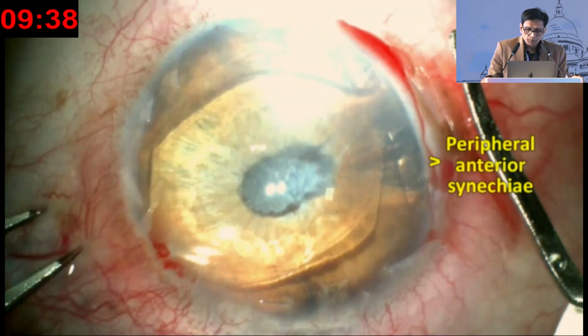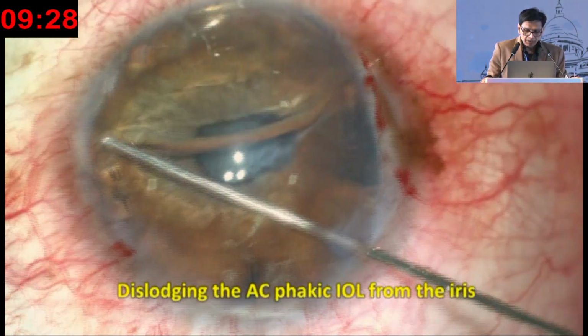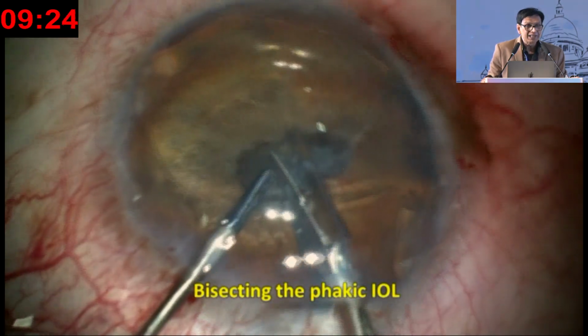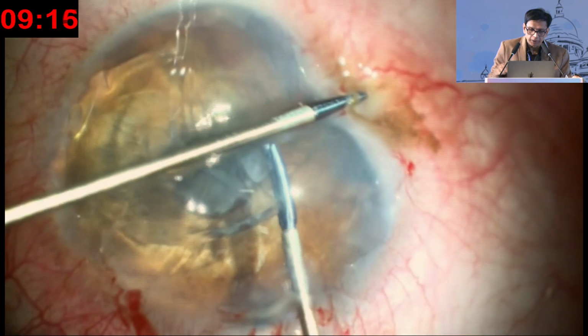You can see now, I'm taking off the epithelium to see better. Look at the peripheral anterior synechiae on the anterior segment OCT. And you can see this is the anterior chamber phakic IOL. Look how mobile it is. That's why this patient will develop this problem. So the first thing I thought was, let me bisect that phakic IOL and explant it.